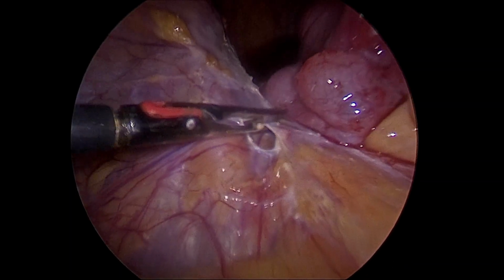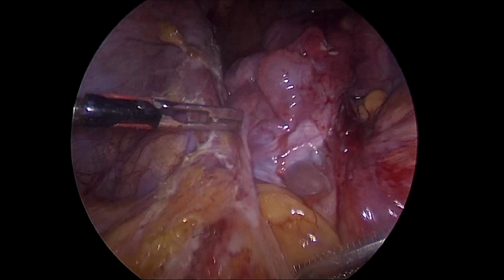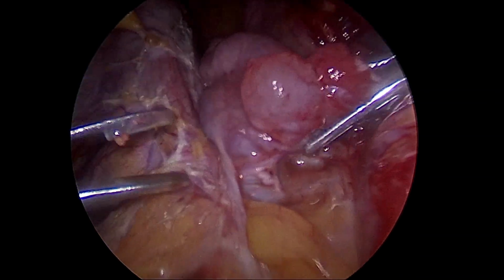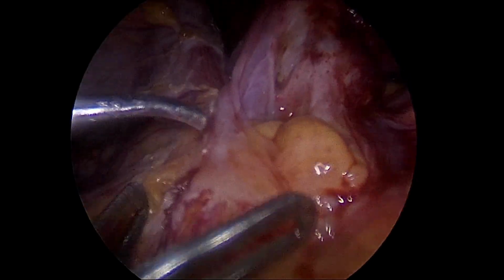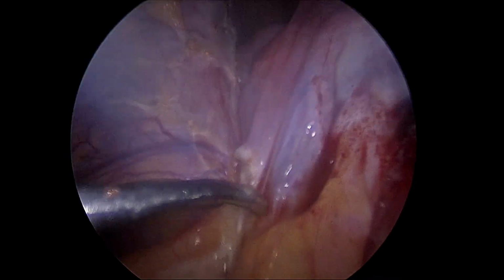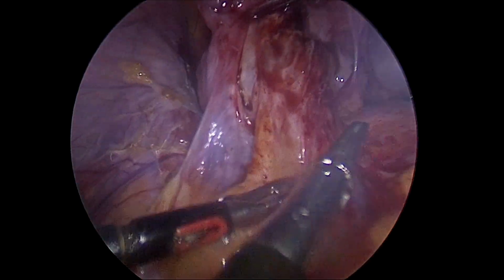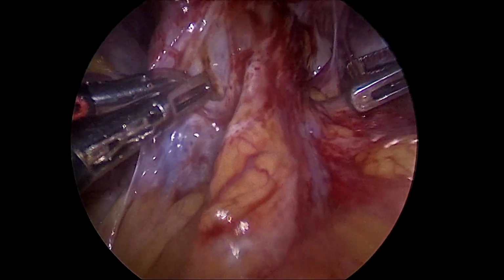The advantage of the shearer is precise cutting along with coagulating, and more importantly it can be used multiple times and the cost is significantly lower. I've been using it for almost 10 years now with absolutely no problems and excellent cutting capabilities.